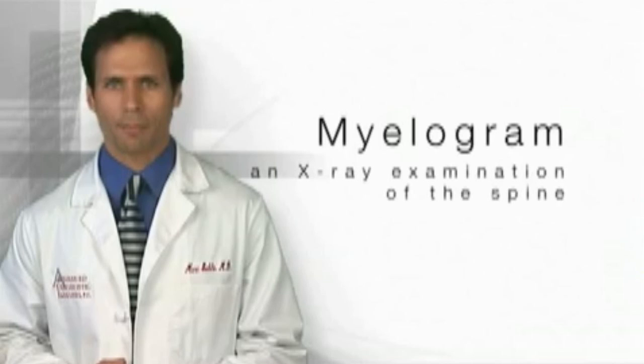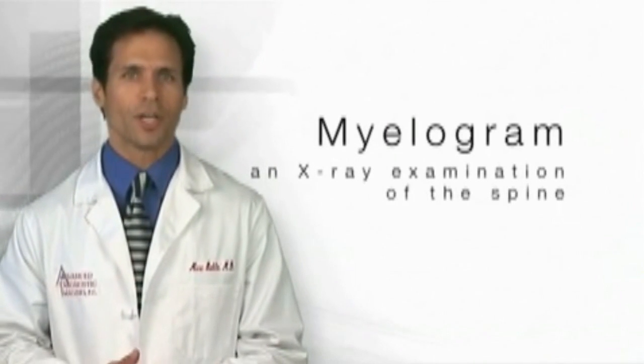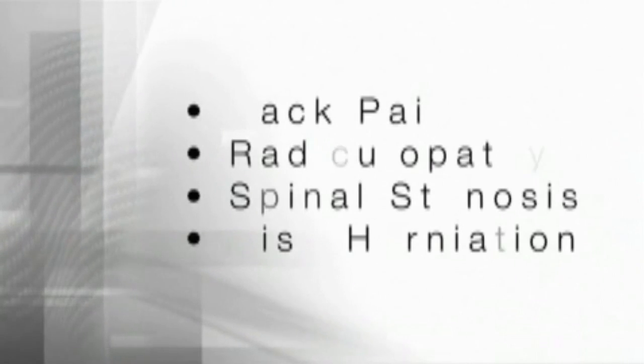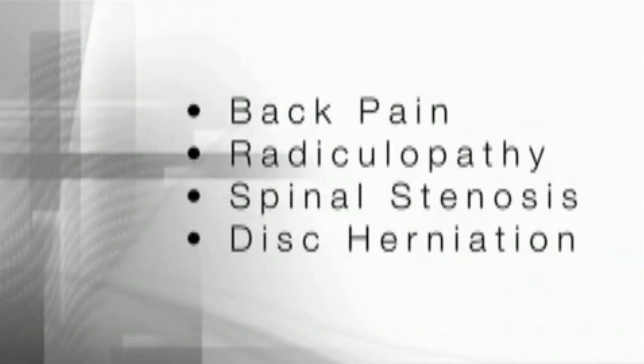What we're going to do now is talk about what a patient goes through when they come in for the procedure. A myelogram is an X-ray examination of the spine involving the injection of a contrast material to outline the spinal canal and nerves. It is commonly performed to evaluate back pain, radiculopathy, spinal stenosis, and disc herniation.